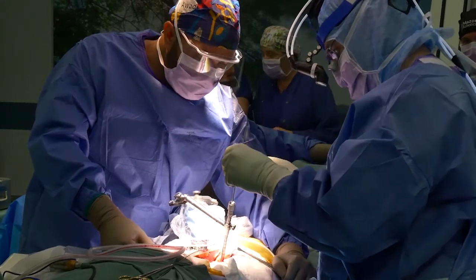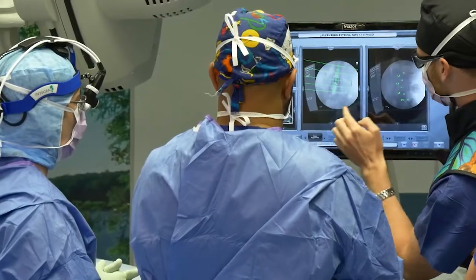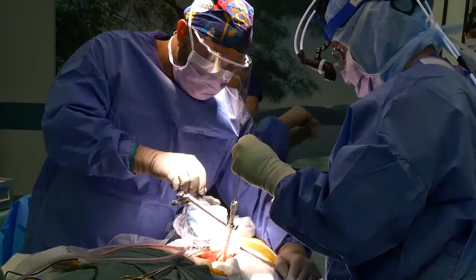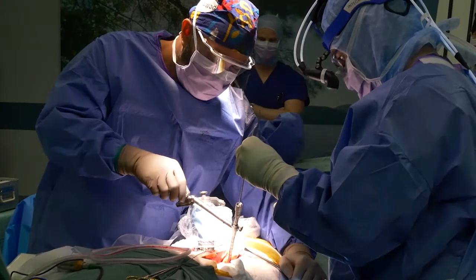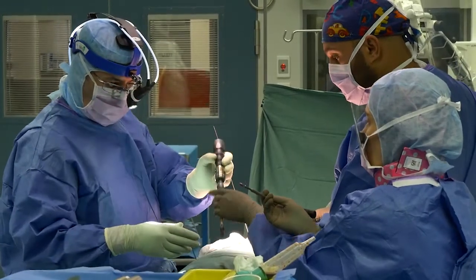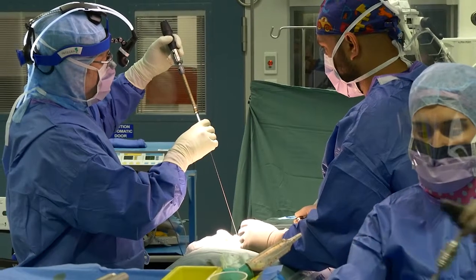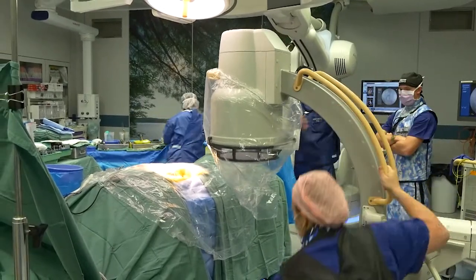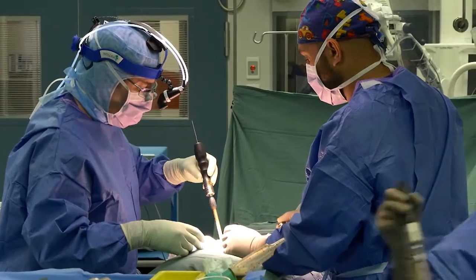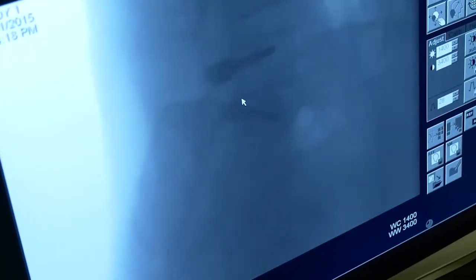Surgeons trained in complex spinal surgery and robotic spinal surgery are able to watch the instruments and watch the robot very closely to detect any potential problems and avoid these before they occur. Once the holes have been drilled in the spinal bones, fine wires known as K-Wires are placed in them. These K-Wires act as markers and x-rays are then done to make sure that they're in exactly the right position. The screws are then carefully drilled over the top of the K-Wires into the spinal bones. The K-Wires can then be removed, leaving the screws in their final position.